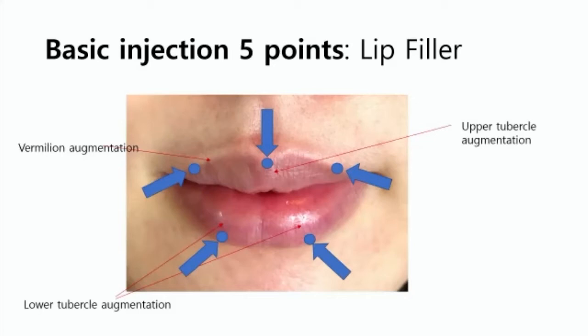If you want to inject filler in the lips, the basic injections are necessary. Other points depend on each lip shape, the border shape, and the volume size.